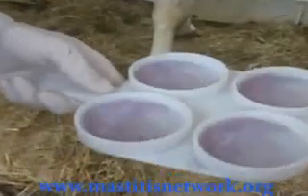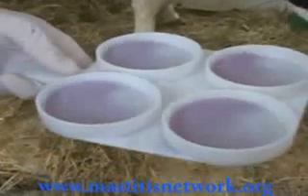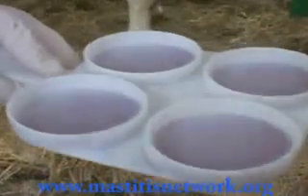Because of the qualitative aspect of the test, on-farm results may differ from what you see in the video. The interpretation may also vary slightly from one user to another.